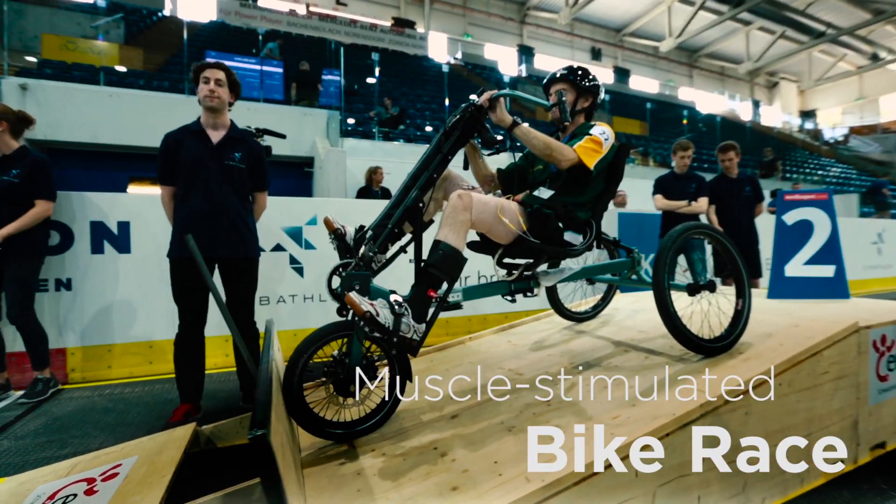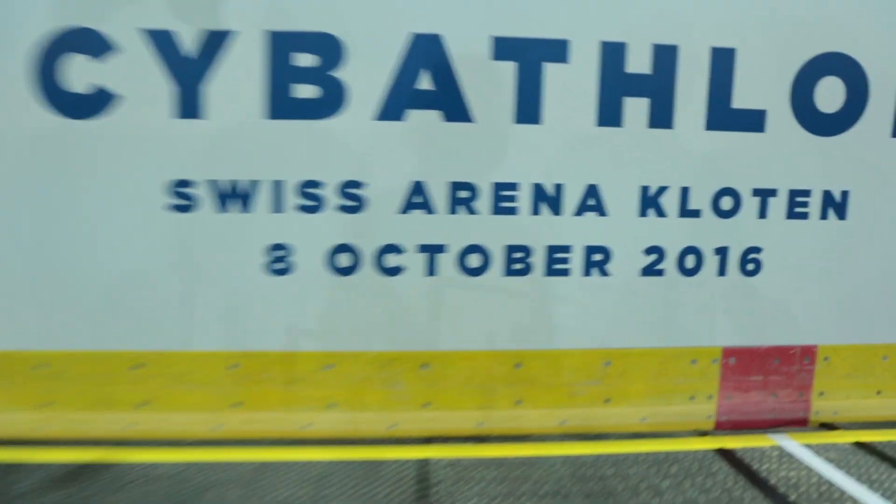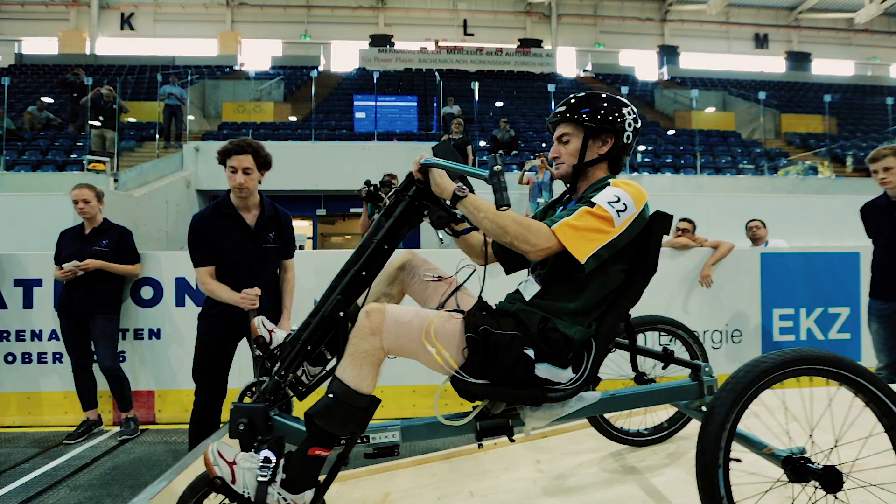It's rocket science, isn't it? Three, two, one.